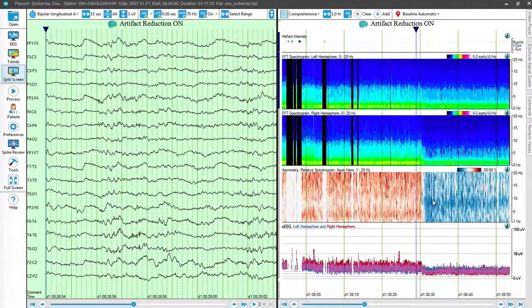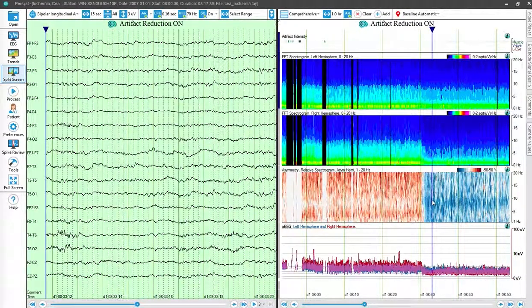Well, pre-clamp and post-clamp. You can see that post-clamp there's a loss of amplitude overall, and according to the FFT spectrogram visually on the traces, we can see that theta to alpha range is lost a bit more so than anything else. So let's see what we see in the trends. FFT spectrogram, again, we see this loss of the brighter colors here post-clamp in that theta to alpha range. We see that reflected in the waveforms.